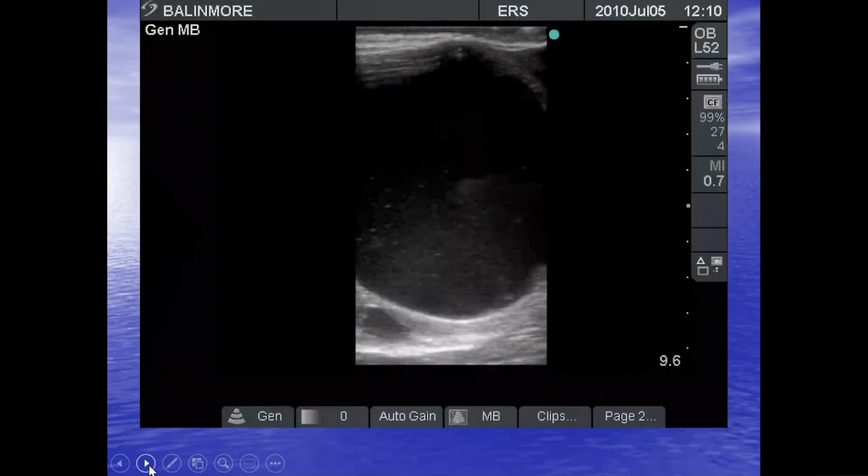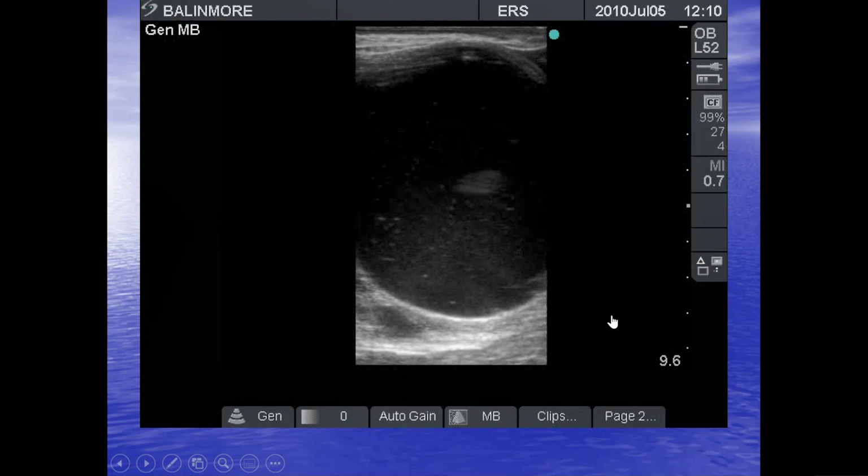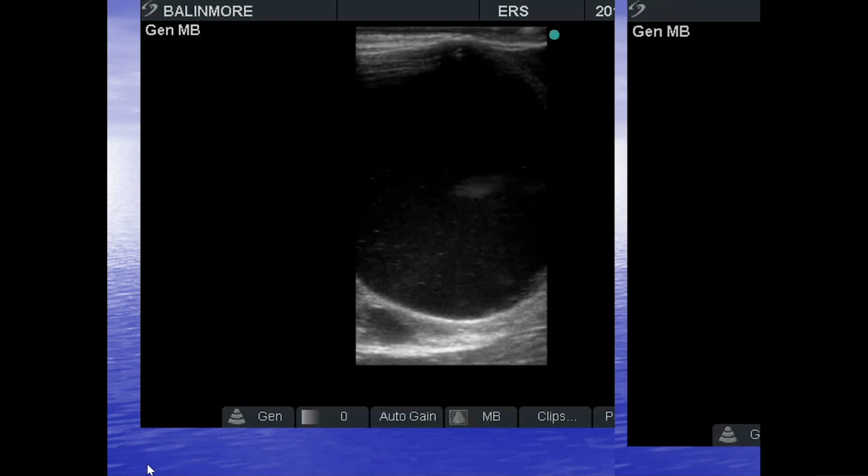If we look at some video clips, look, here's a mare. Is that a hemorrhagic follicle, or is it a normal mare? Is it a follicle going to ovulate normally? Look, you've even got this sort of, I presume, some kind of fibrin blood clot within it. Is that a normal mare or not? Look at your scale, 9.6. So this is 1, 2, 3, 4, 5, 6, 7, nearly 8 centimeters, this follicle. Yeah, I'm putting that in the category of anovulatory hemorrhagic follicle.